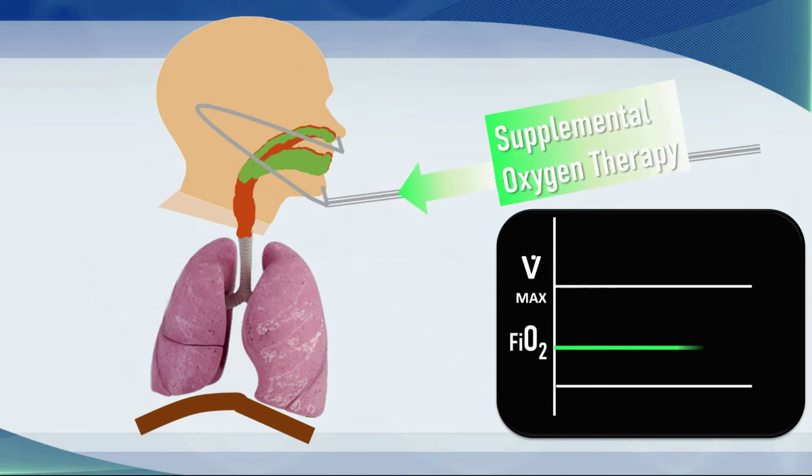Oxygen is delivered via the tubing to the nasal specs, and then the nasopharynx acts as a reservoir. Note that we have continuous flow of oxygen, and based on the flow of, say, 2 to 6 liters, we believe that the FiO2 is predictable. Again, there is no current inspiratory or expiratory flow, so this is the steady state situation.